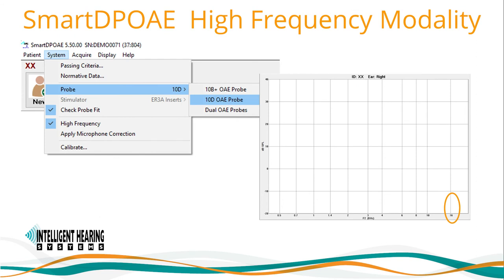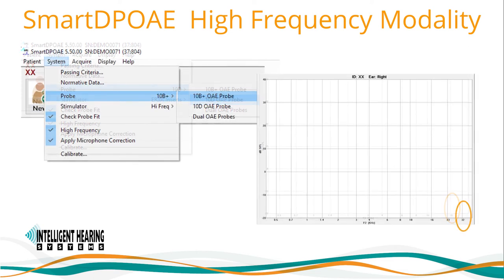The Smart DPoAE software offers a high-frequency modality. Clinically, it can be used for ototoxicity monitoring using a 10D probe. To enable this mode, activate the high-frequency modality in the system menu, which allows testing F2s up to 16 kHz. The DPgram will expand from the standard 12 kHz to the 16 kHz DPgram. For animal researchers, a 10B-plus probe microphone with applied microphone corrections and special animal-only high-frequency transducers are set up to test up to 32 kHz. The parameters menu will allow for the expanded frequency range.